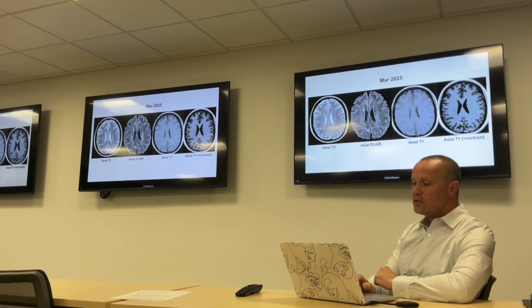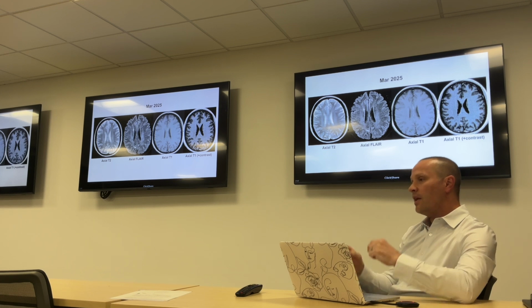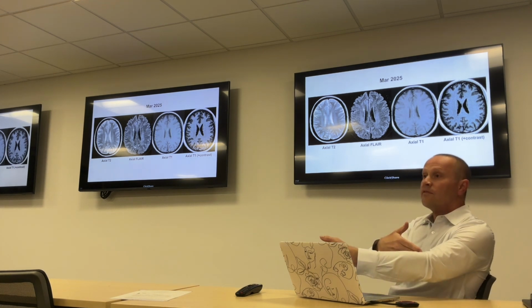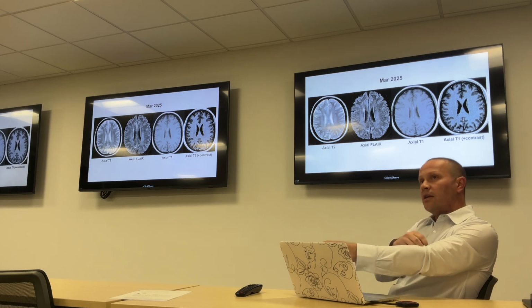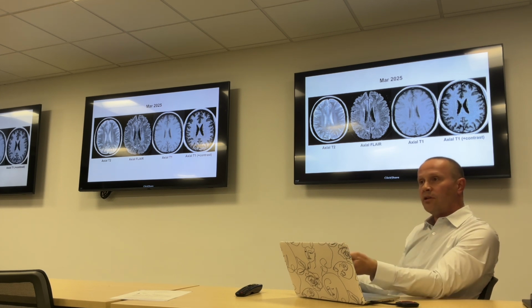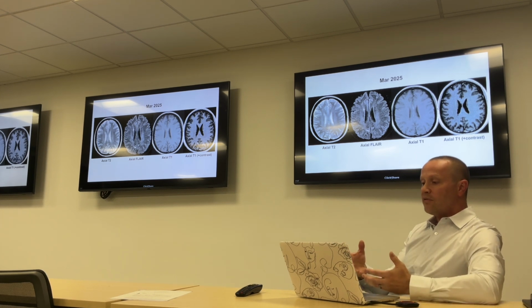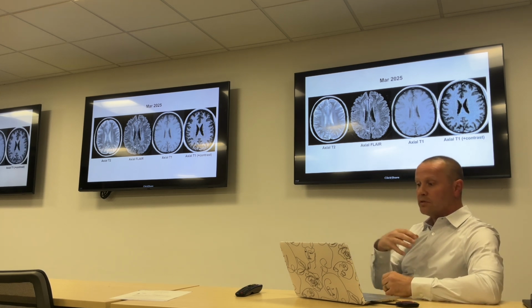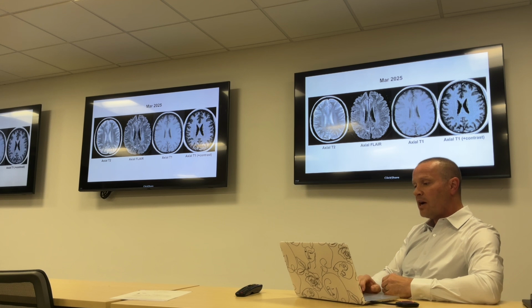But the use of it is that once we give contrast, we can see that in this case, this new lesion that wasn't there a year ago is also showing enhancement. Enhancement just means the blood is flowing to that lesion. We give contrast into the vein, and the contrast goes wherever the blood goes. So things that are acutely inflamed or active, like an MS plaque, will deliver more of the contrast to that spot, and that's why they show up as bright enhancing things.